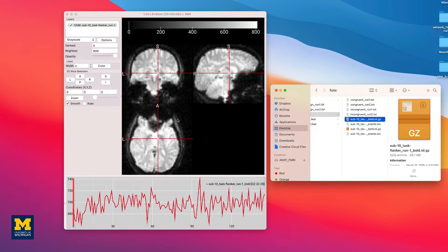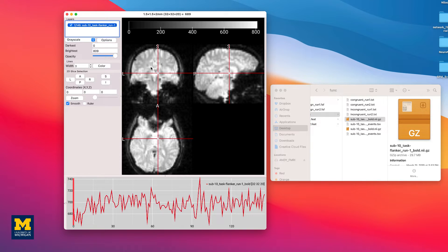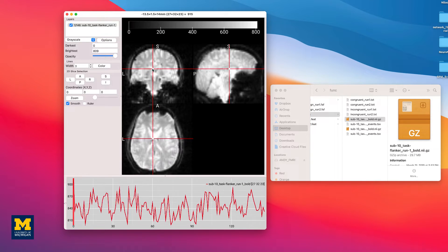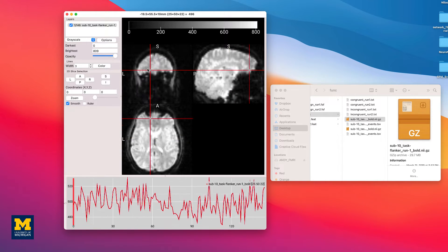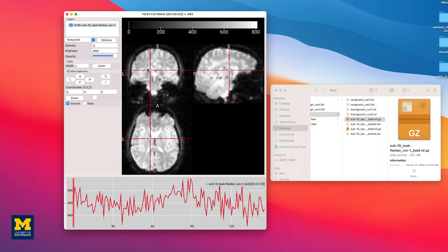As you saw in an earlier chapter, left-clicking and dragging in any of the window panes will move the crosshairs, which in turn updates the view in the other two panes. You can keep the crosshair where it is and scroll through the slices in the current pane by scrolling the mouse wheel either up or down.